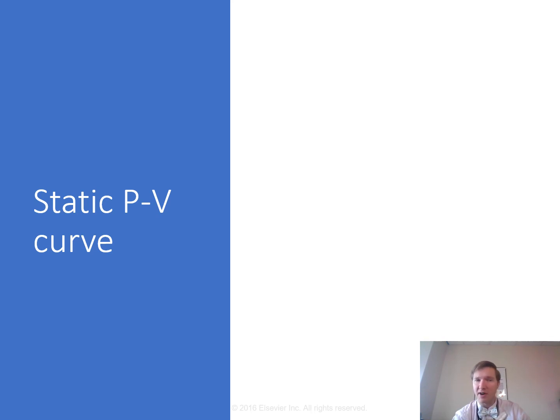With mucus plugging or bronchospasm, this condition increases. Do you see this graph right here? With mucus plugging or bronchospasm, the airway resistance increases and the dynamic compliance shifts to the right and flattens out, because there's more pressure required for this patient, and the static compliance remains unchanged. So with conditions that reduce compliance, both curves will shift and flatten. It's been shown to be pretty useful in treatment for patients with ARDS.